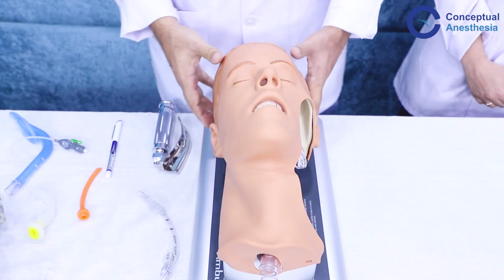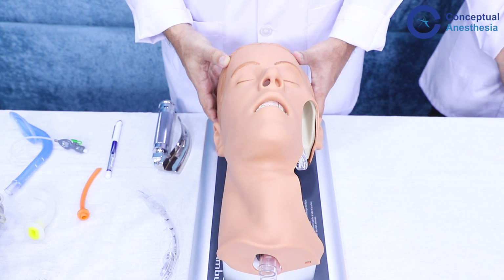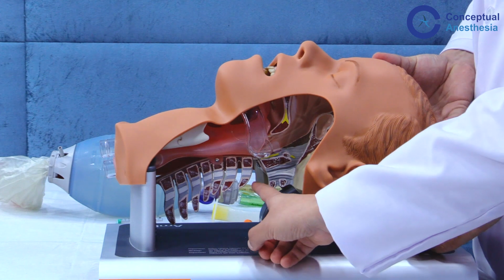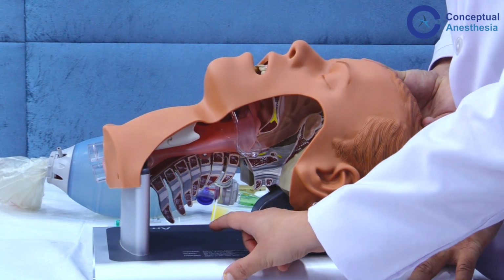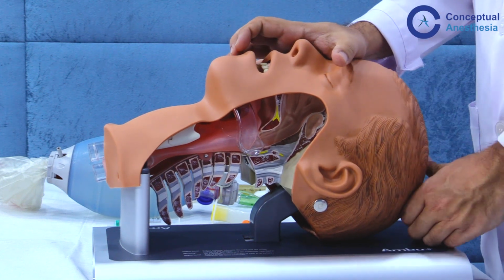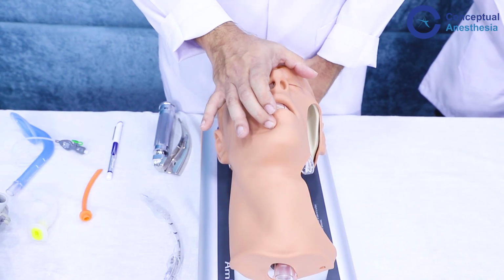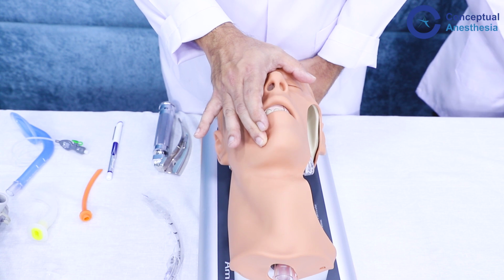So now I am going ahead with the intubation and sir will teach us the steps of an ideal intubation. So as you can see, the first and the foremost thing is to give correct position to the patient. The ideal position is to give head extension and this head extension is given at the atlanto-occipital joint. This position is also commonly called as sniffing the morning air position. Now the next thing I have to do is open the mouth of the patient. So the mouth is open.